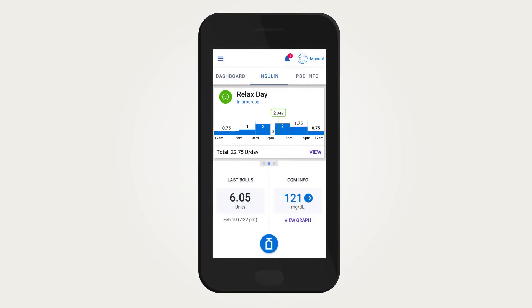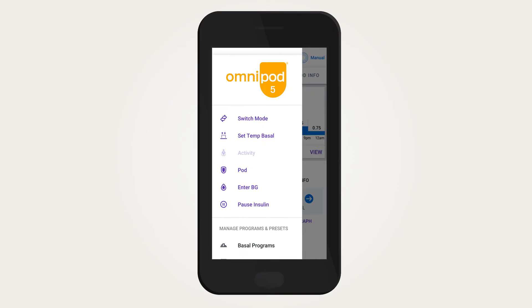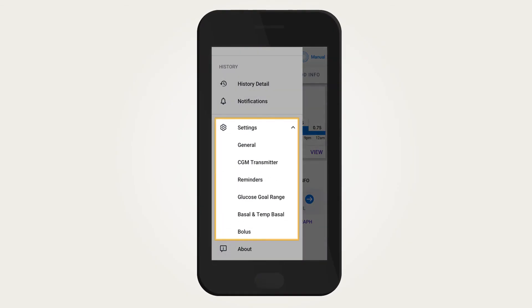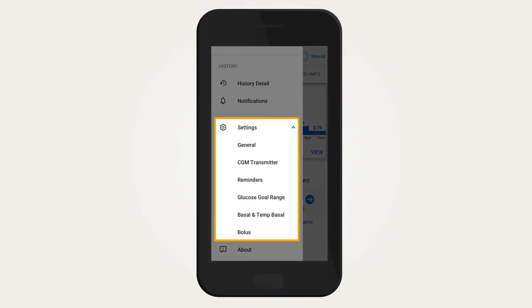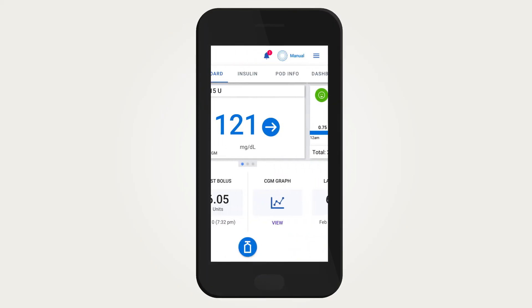Switching to manual mode most often occurs when you are changing pods or CGM sensors. Switching is also required to pause insulin delivery, edit basal programs, change time or time zones, and some uncommon occasions when the system requires you to do so.